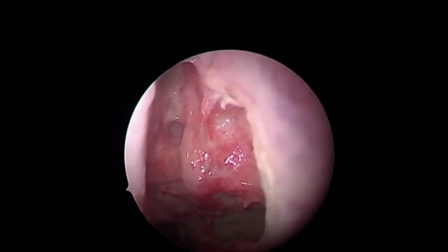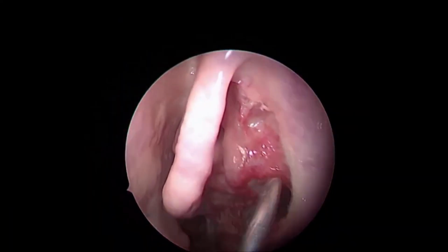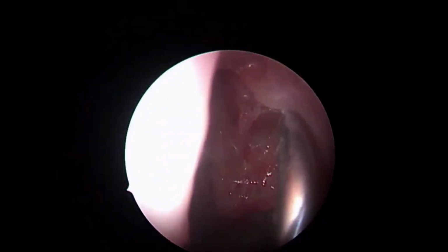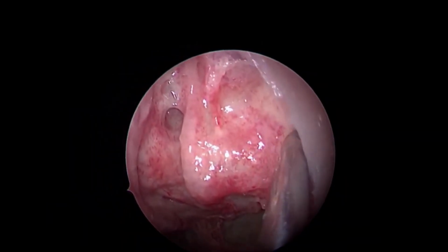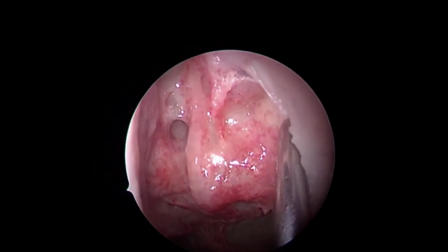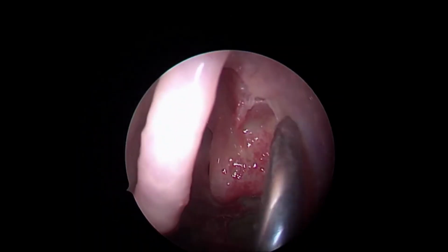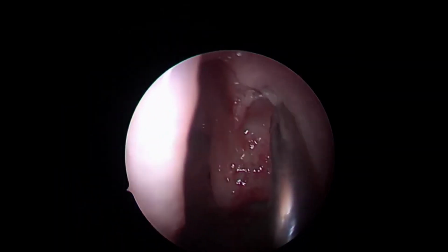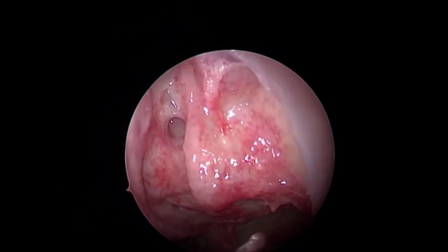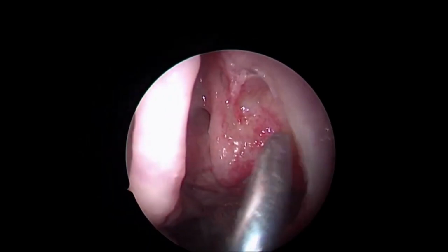Now see what I'm trying to say here, like I mentioned to Professor Prepagaran, why we use this reverse biting forceps for the uncinate and not the sickle. See this, as I remove the upper part of the uncinate, how close this is to the medial orbital wall. This is the medial orbital wall where this bulla ethmoidalis is attached. And many a time we have seen this is even closer to the uncinate, and the moment you stab your sickle knife, you are in the orbit. So you have to be very good at the radiology, and if it is so close, avoid that.